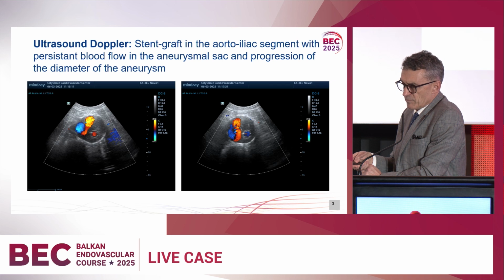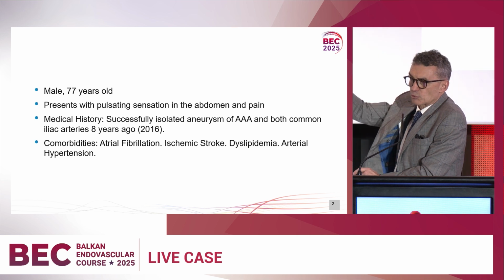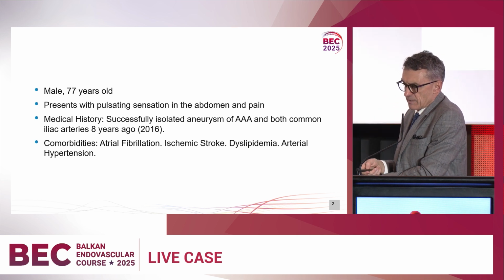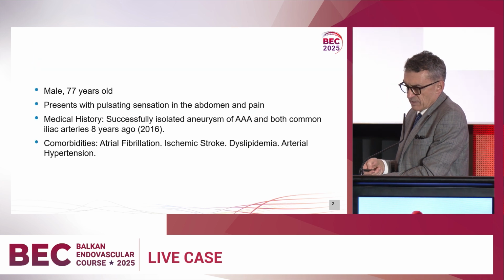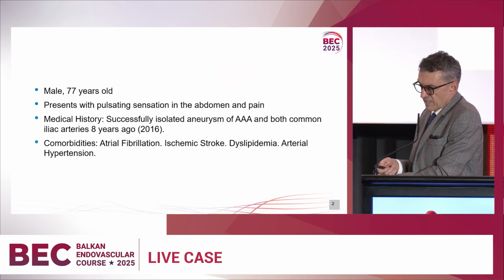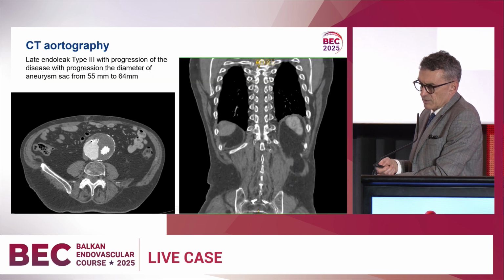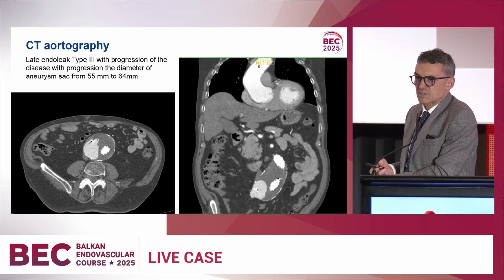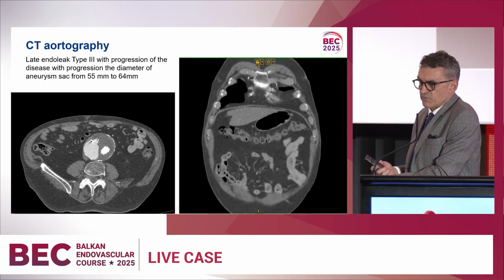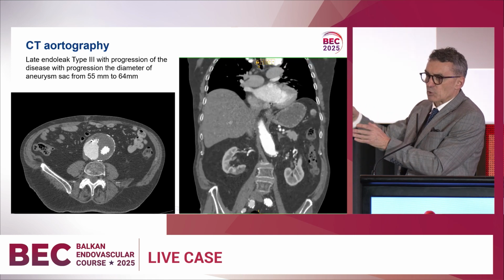Even during the first intervention it was quite a challenging case because there is a proximal tortuosity as well, and in tortuous anatomy it's quite demanding. During the implantation you have to pay attention to all the branches, because after the procedure is finished, the anatomy is tortuous again.